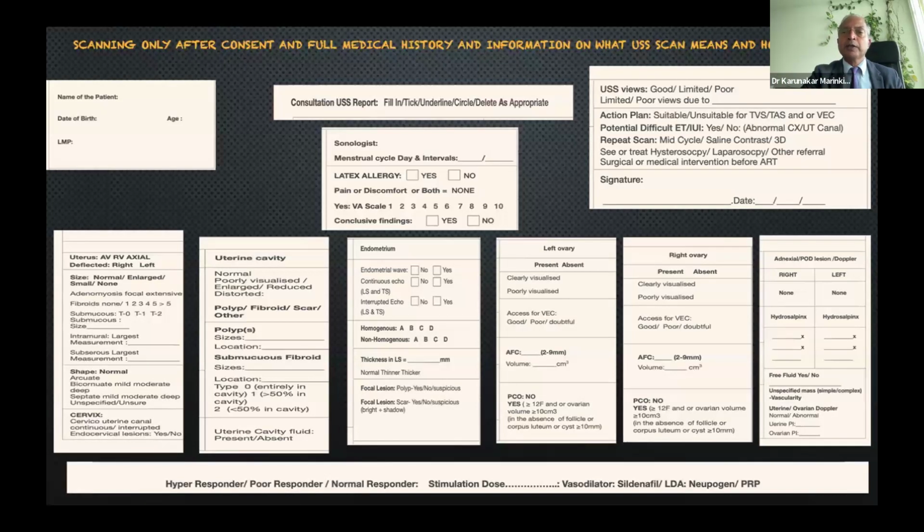That's not an issue. But it depends on the appetite for excellence that drives you to be excellent in what you do for the rest of your career. And sometimes when I do a scan, I do require a repeat scan. It can be by chance that it did not happen to be mid-cycle, so I call her for a mid-cycle scan. Maybe we did not make arrangements. She's a walk-in patient. I'll call her again for a contrast scan.